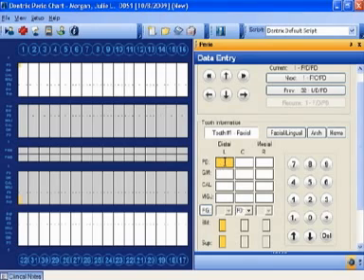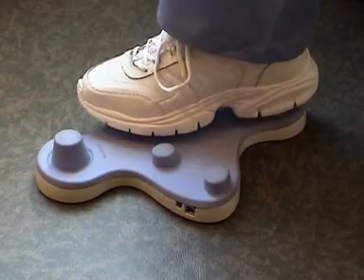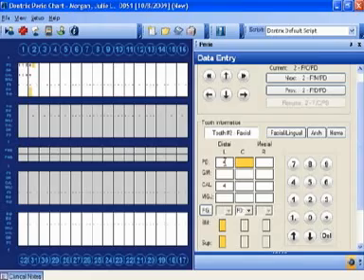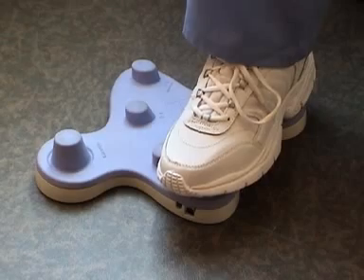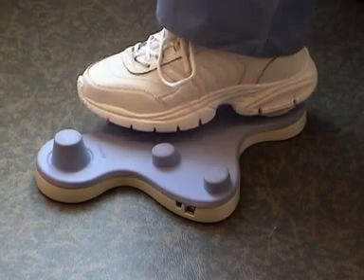So you just start entering your numbers, and these are your numbers here across the middle: 1, 2, 3, 4. And if you hold them down for over a second, the 1 becomes a 5, 2 becomes a 6, 3 becomes a 7, and 4 becomes an 8.